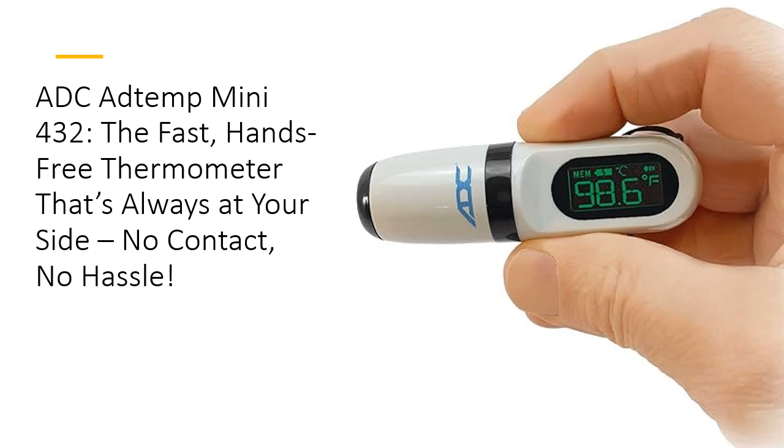With 9-reading memory and a sleek digital display, staying informed has never been this smooth and simple.